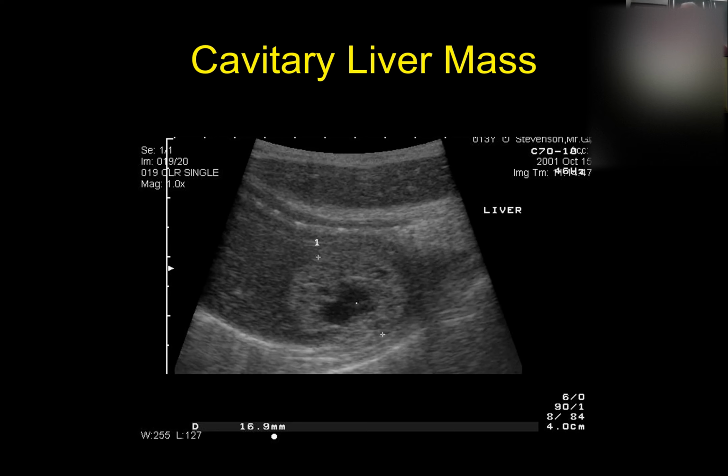Okay. So if I'm looking at this and I think there's a good chance it's malignant and we need to put a needle in it to get those cells out, then you can advise the owner, I really do think it's malignant, but we're going to have to get some cells out of it to know for sure. Well, that owner may choose then, if you really think it's malignant, like that last one we looked at, I'm not sure I want to spend the money to do that, or I'm not sure I want to put my dog through it, things like that.